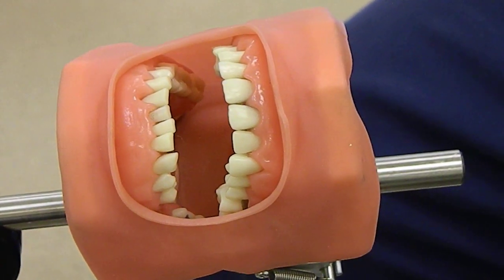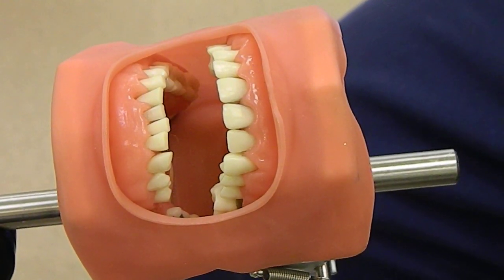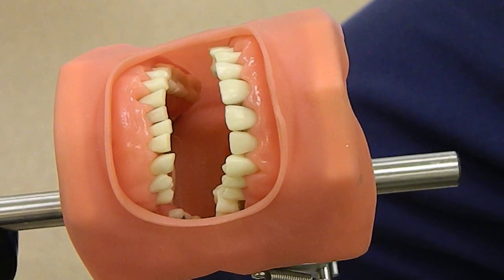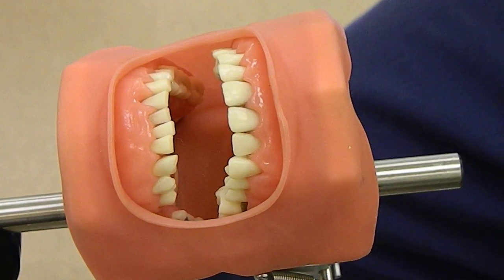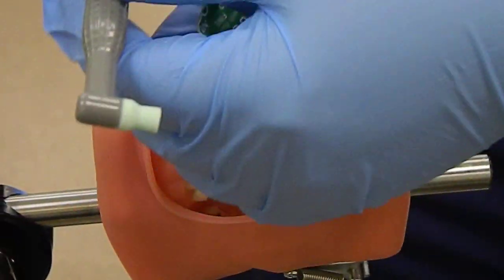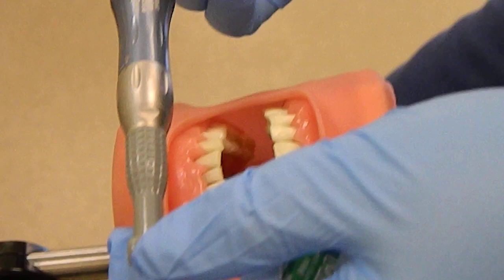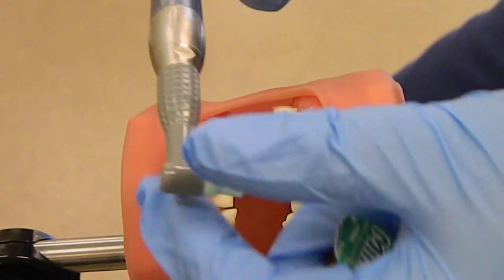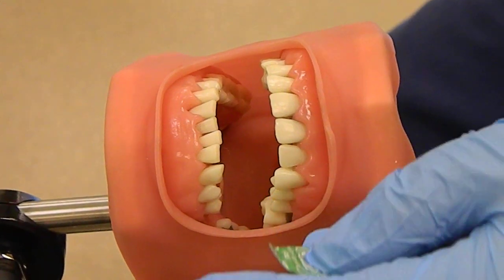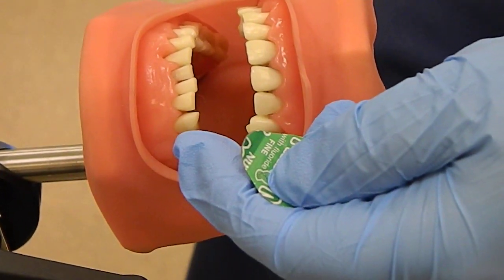For polishing, we are going to go through the whole technique. Our rheostat has to be on the correct setting. This is my handpiece here. We have the motor and the cone, and we have our profi angle. We also have to get our profi paste here.